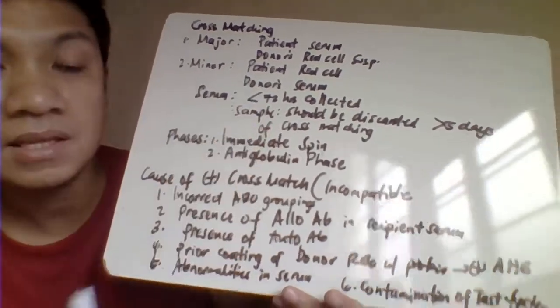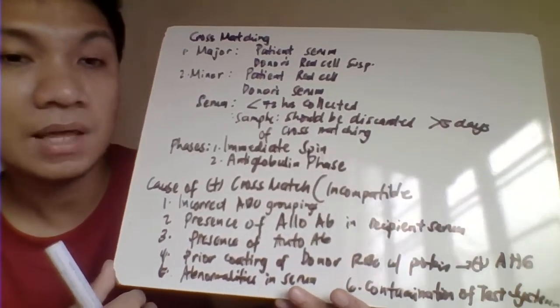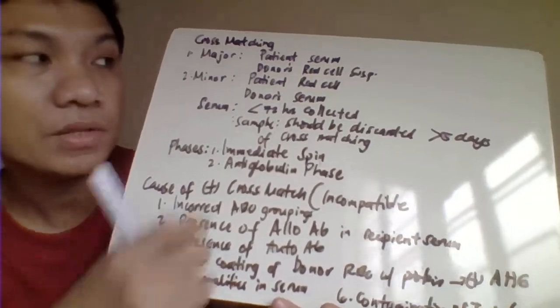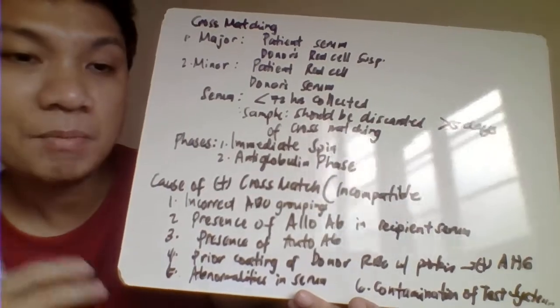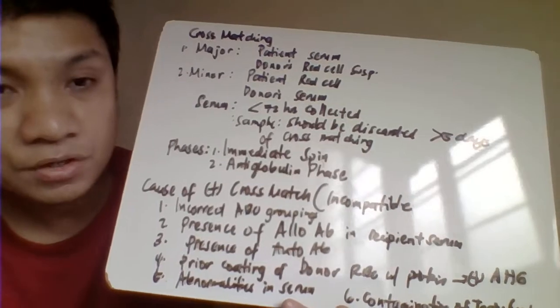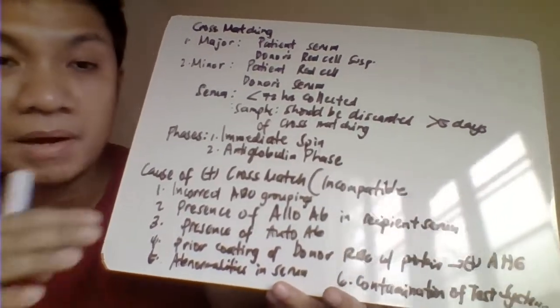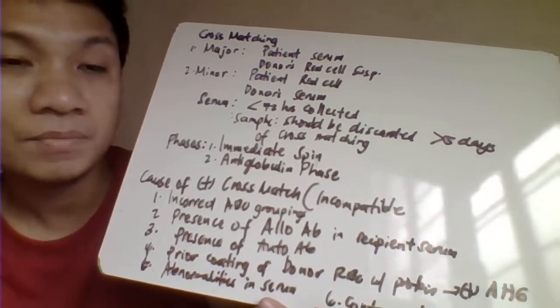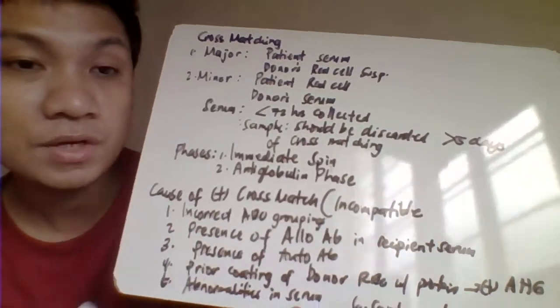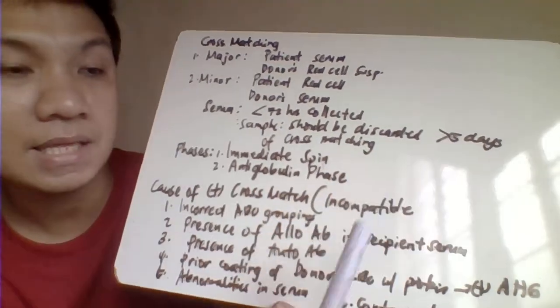So, for that, ang serum natin should be less than 72 hours. And after that, mag-perform tayo ng compatibility testing. You store the blood na ginamit for compatibility testing for both the donor and recipient. After 5 days mo pa pwede itapon. Bakit after 5 days? Because after the blood transfusion, baka magkaroon ng untoward agglutination reaction o transfusion reaction. So, pag nag-investigate sila, kailangan may sample ka pa rin sa ref. Hindi mo pa muna tinapon in order for you to check kung tama o hindi ang ginawa ng medtech. So, after 5 days mo pa siya itatapon.